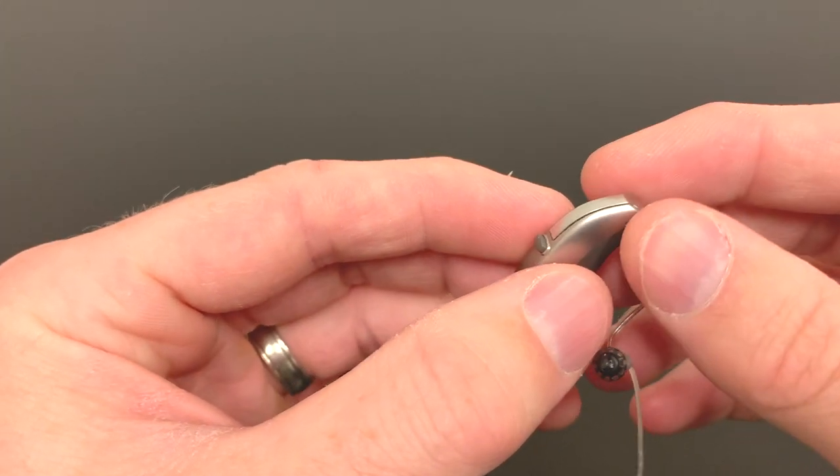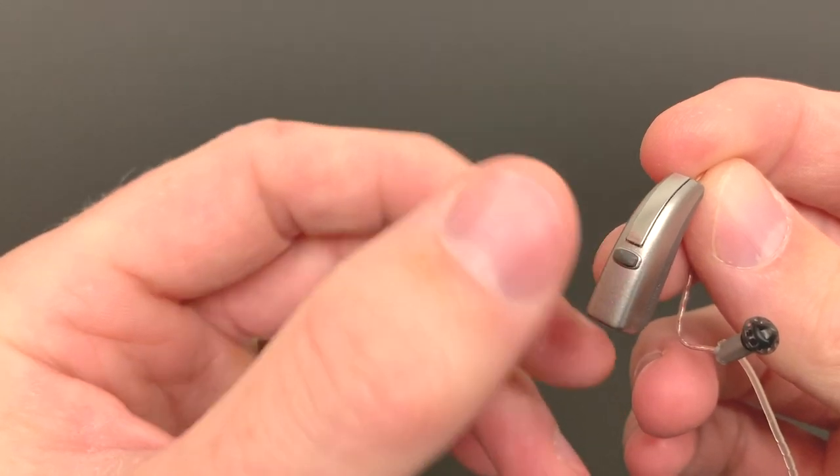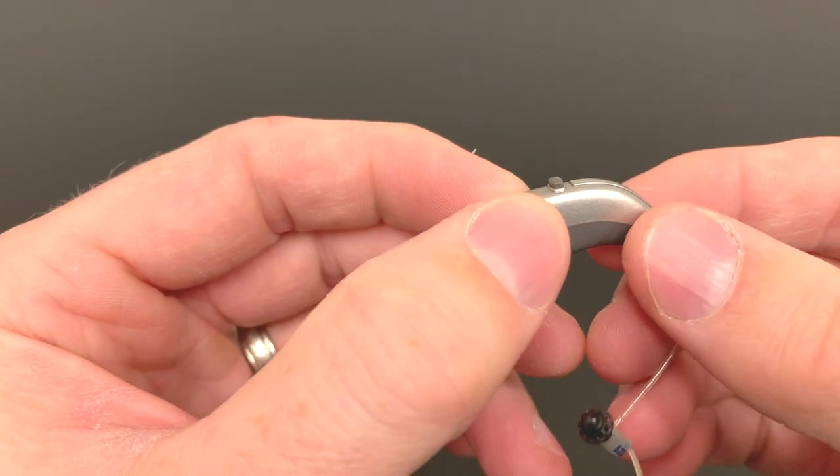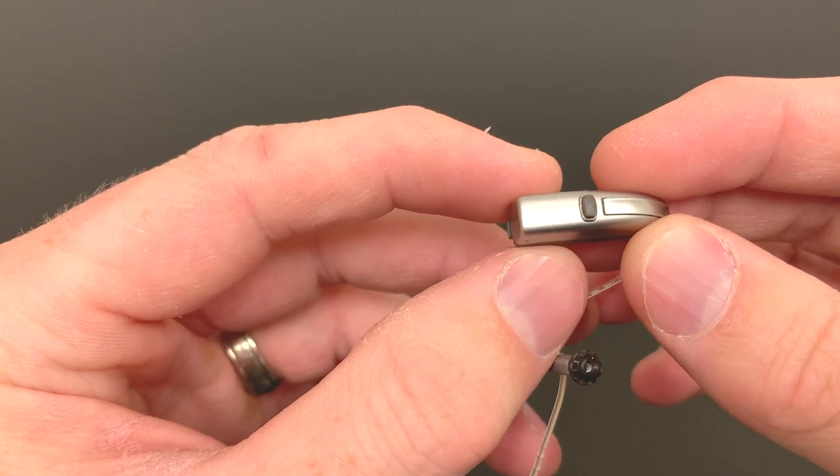Let's start on the back of the hearing aid. In most of these, you have a program button right back here that can be used to set various settings with the hearing aids, including volume control and program changes.